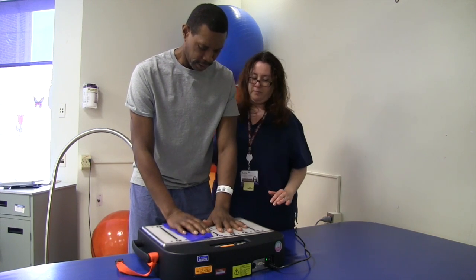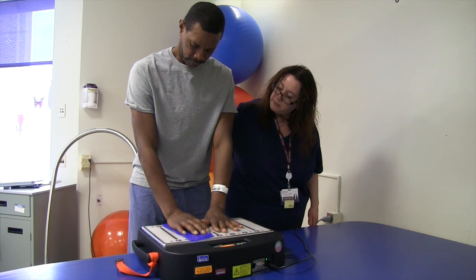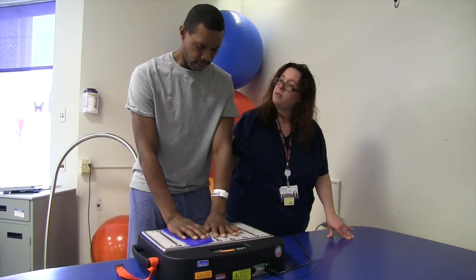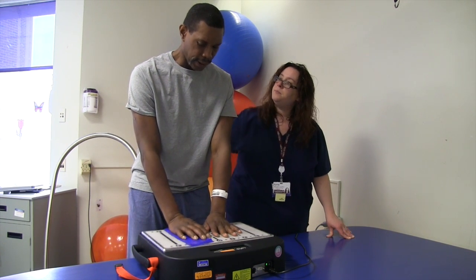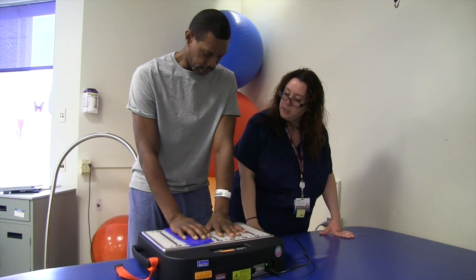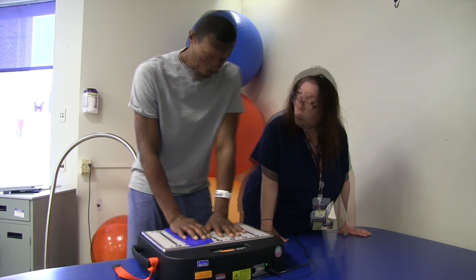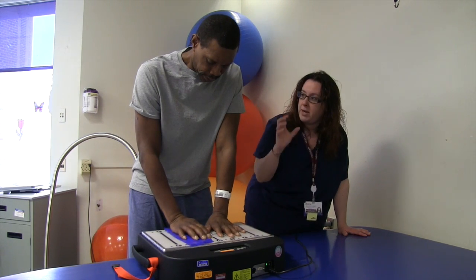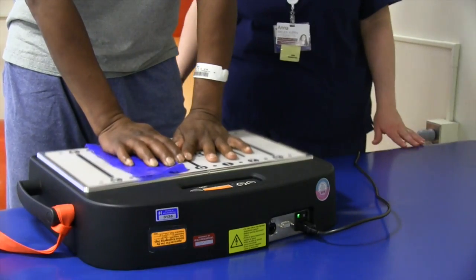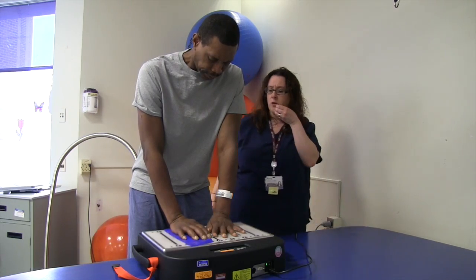Just go down and put a little weight through it — you can bend up the elbows a little bit. Now when you straighten out your elbows completely, where do you feel it more — in the arms or more back here? It's staying in the arms. Okay, lean into it, bear some weight. There you go. I feel like to work the triceps — elbow extension is what we really have been trying to strengthen, and that will definitely work those muscles.